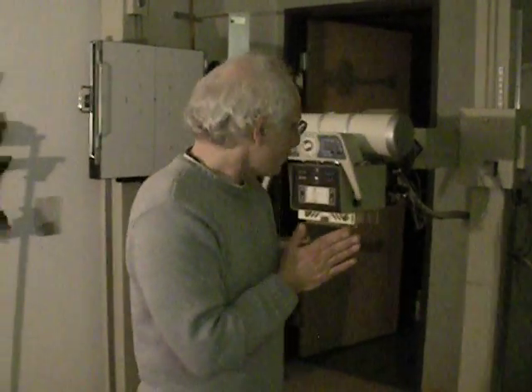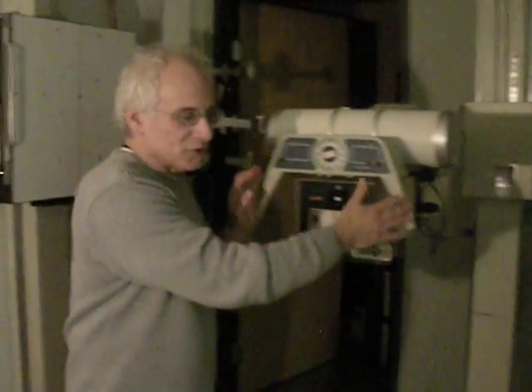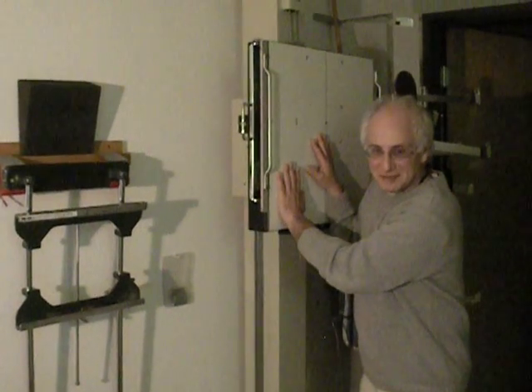We're going to do some radiographic positioning of the spine. I would like you first to be reminded of these basic ideas that I'd like to present. That we have 3 components to these X-ray exposures. 1, the X-ray tube. 2, the film or cassette. 3, the patient.